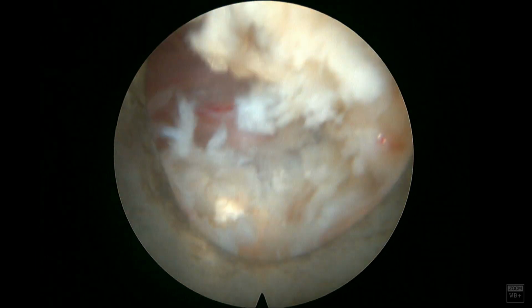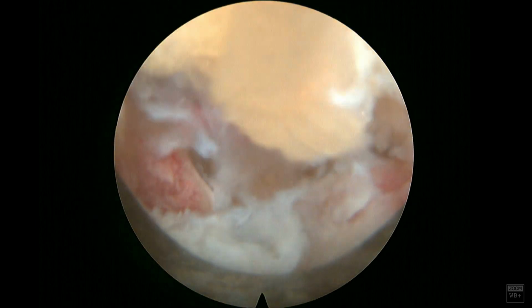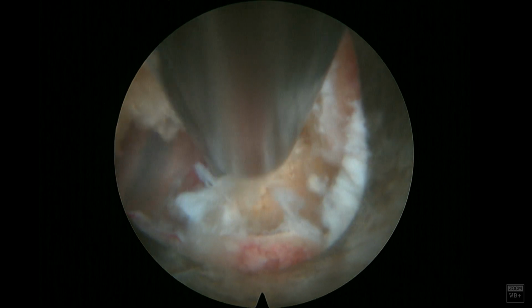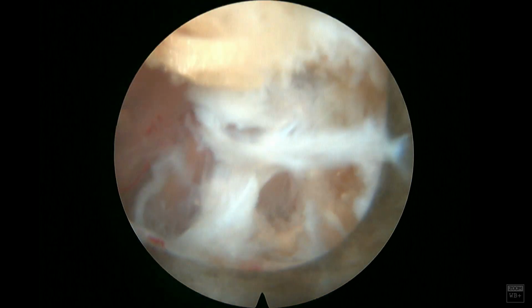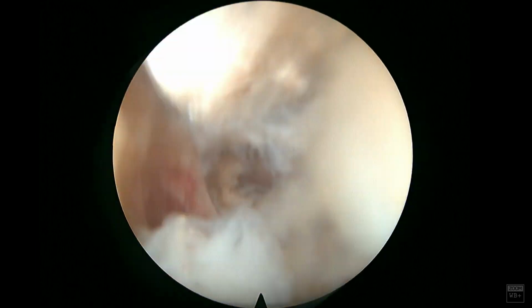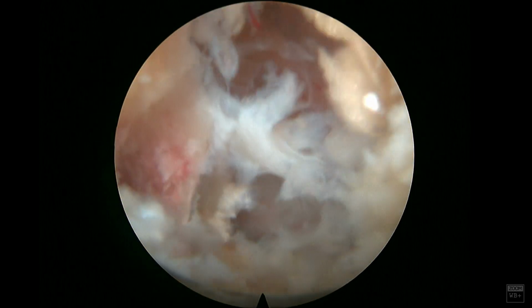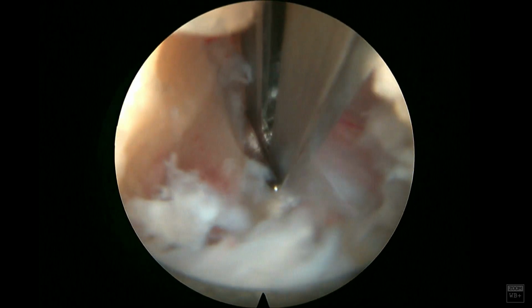So now you can see that the osteophyte is gone. There's remnants of the cysts down below. And the reason I call this a cyst is because I believe that it was a combination of a hypertrophic facet as well as a facet cyst. And so here I can start using the Kerrisons to remove some of this softer cartilaginous osteophyte. Some of it may be cartilaginous facet capsule, and so I'm also using the Kerrison to free up some of the adhesions from the dura at this area too. So I always make sure that I come in with the shoe of the Kerrison back to the dura. I never want to use a sharp end towards the dura, and so I always take 90-degree bites, just like you would during an open procedure.